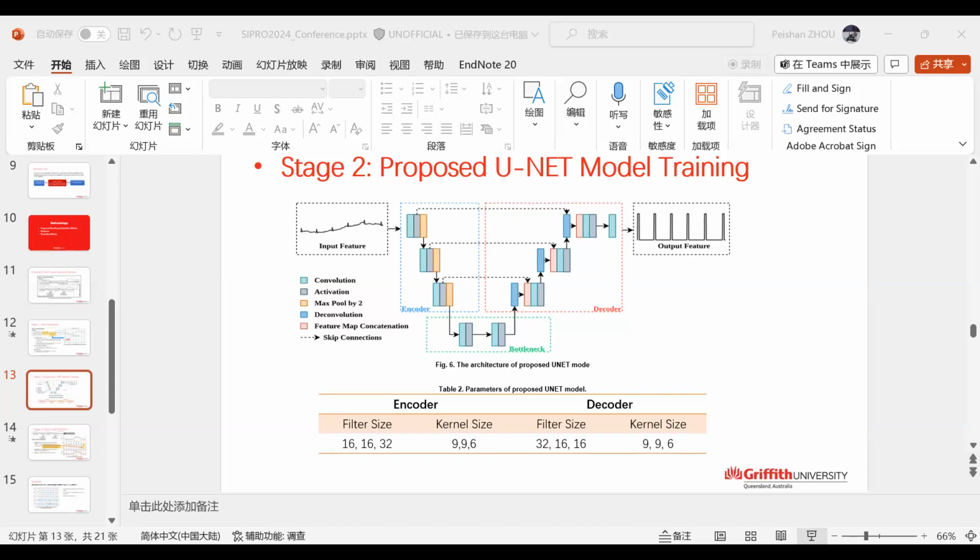When the prediction is set within this matching window, it will be considered as a true positive or a false positive, depending on whether there is a true R-peak. And it will be considered as a false positive if the prediction is outside this matching window.